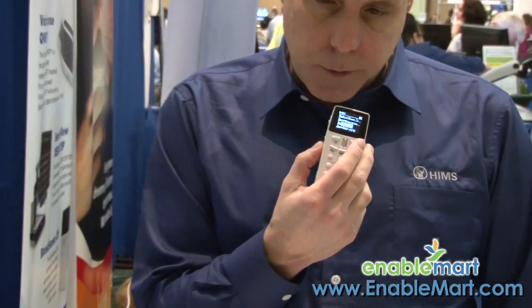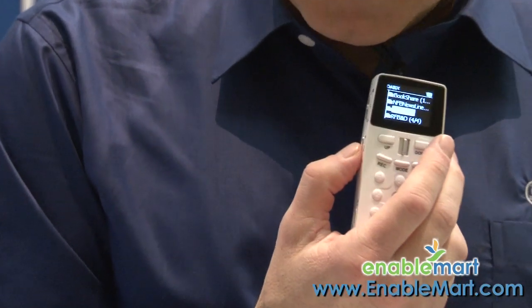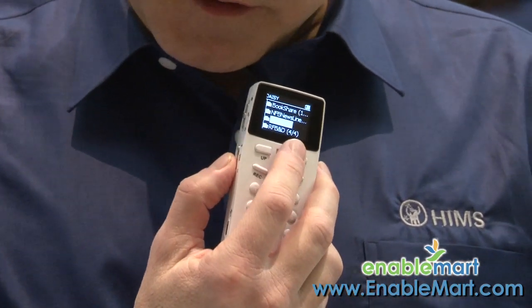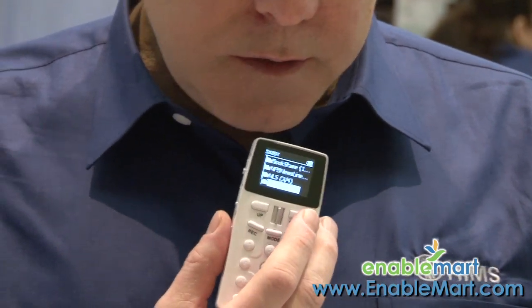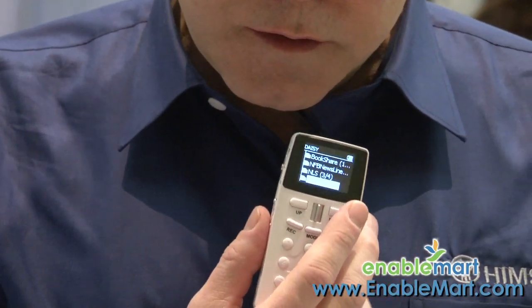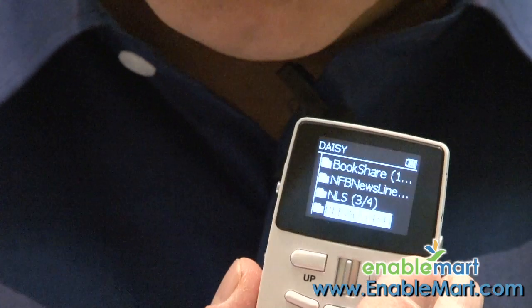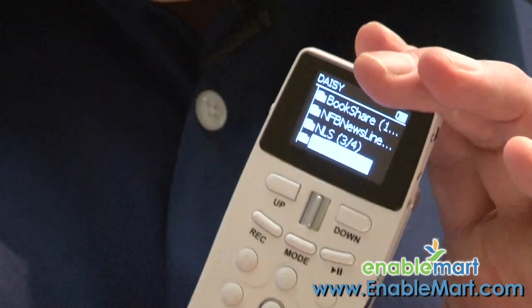The National Library Service for the Blind — talking books — you can download those and play them on your BookSense or BookSense DS. RFB and D — for those of you who are students, you can literally now grab your textbook online, download it, and read it with the BookSense DS.